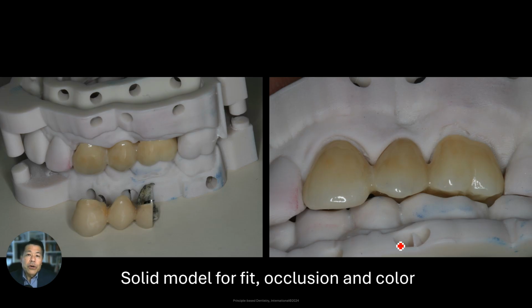So here's the zirconia bridge. It was a 3-unit bridge. What you see on the bottom of the left-hand photo is the old PFM. I cut the PFM off and sent it so the lab could match the colors. Now what you see is that it didn't take much to get that bridge off. The front cuspid tooth, the abutment of that bridge, had decay that had been going up under the lingual margin. And we had repaired that area once for the patient at the request of his dentist. He was referred by another dentist to our office to take care of that. And we went up underneath that abutment and we sealed it up.